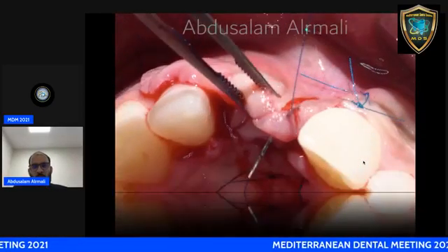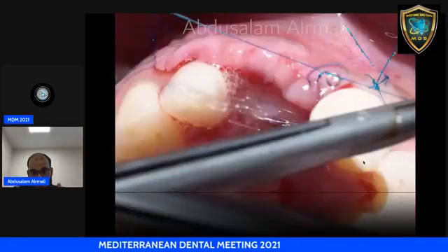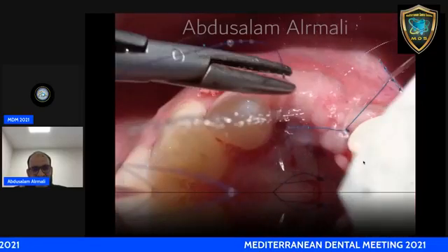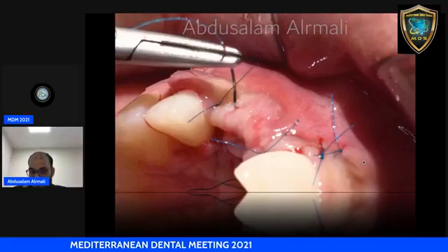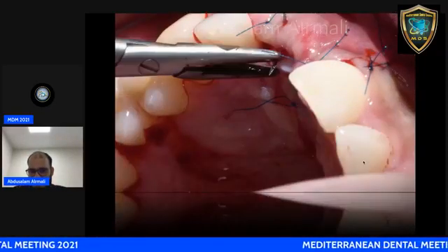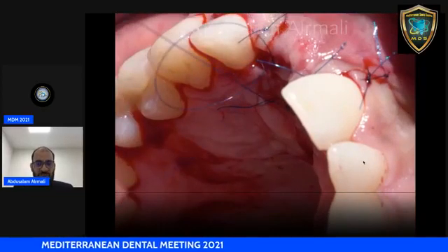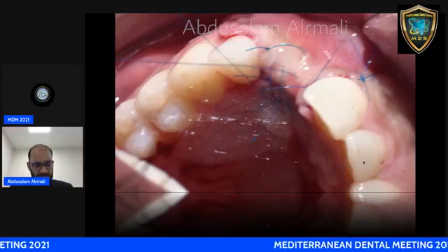Okay, we're going to adapt the surgical papilla that's formed, because of the pre-surgical prosthetic management that gives you this papilla that you are now able to split and suture with the palatal one. If we don't do any prosthetic management for this case, you will end up with maybe another kind of complication that makes the scenario more difficult and more difficult to manage.